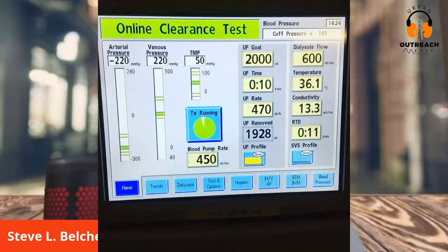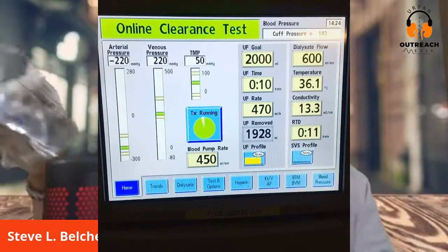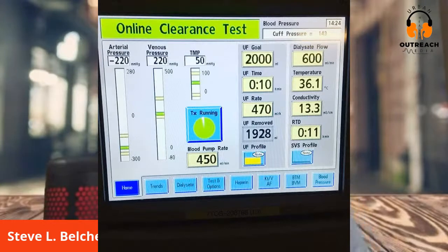So moving down that screen, you've got the UF goal, where they're removing 2,000 milliliters of fluid. To picture that, I'm talking about a 1 liter saline bag, and I'm talking about two of these. That's 2 liters. Then you come down to UF time. That's where I program the time in. If you run 3 hours, I put in 3 hours there.